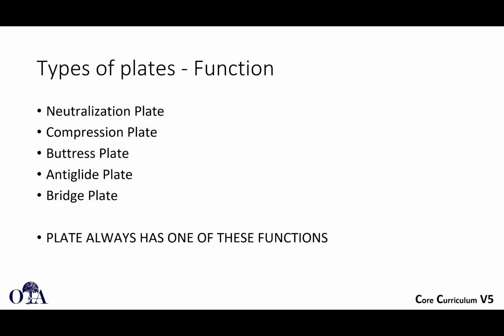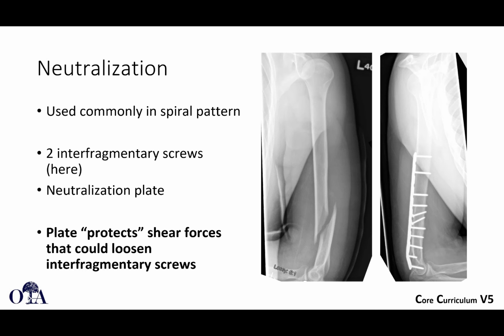A plate can function as a neutralizing plate, a compression plate, a buttress or antiglide plate, or a bridge plate. So a plate can have one of these functions.